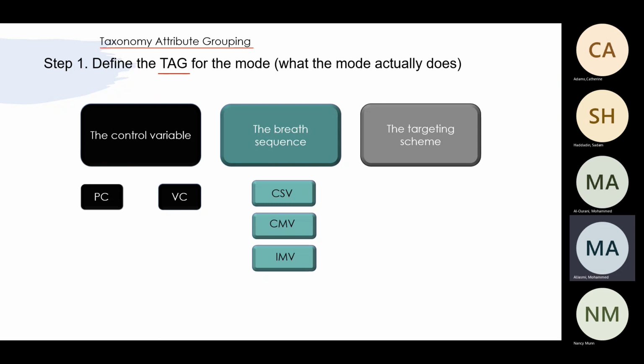Some modes let the patient do it by himself, and I set the minute ventilation. I need this patient to have a minute ventilation of, let's say, 12 liters, okay? Then the patient is doing 12 liters, he gets tired, his muscles get weak, and he starts to have less minute ventilation. That's when the mandatory breaths will jump in and start. That's all intermittent mandatory ventilation.